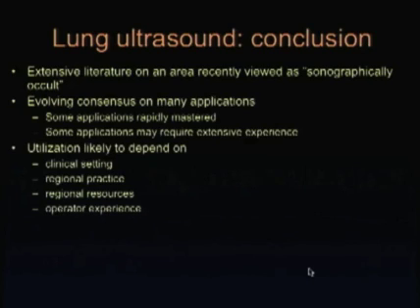Utilization is likely to depend on practice setting, personal experience, personal skill, regional and cultural standards of care in one's community, and certainly resources at one's disposal. I think lung ultrasound is particularly useful in areas that do not have other imaging modalities readily available for assessment of the lung and pleura.